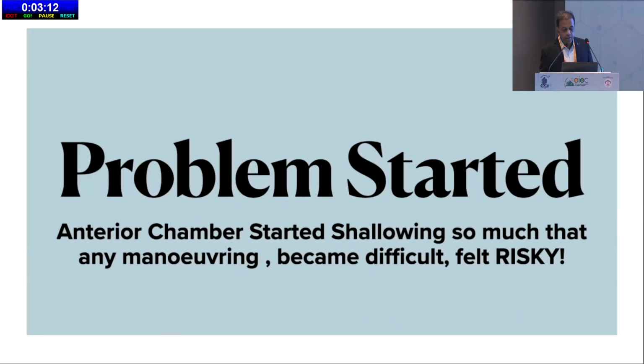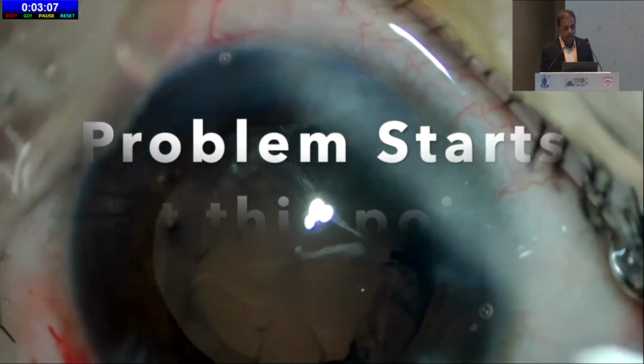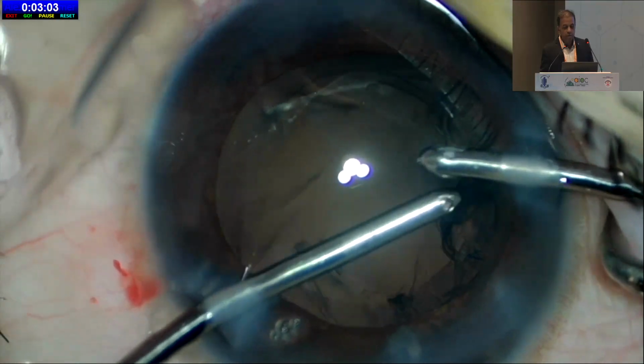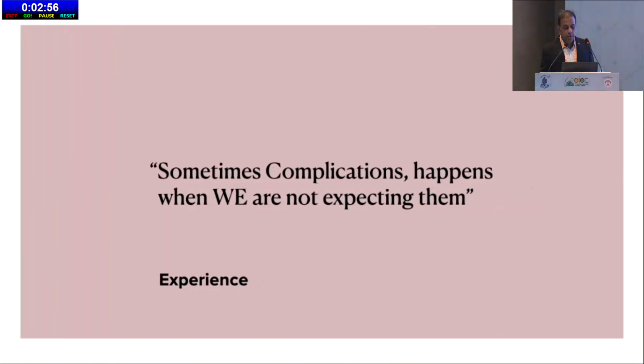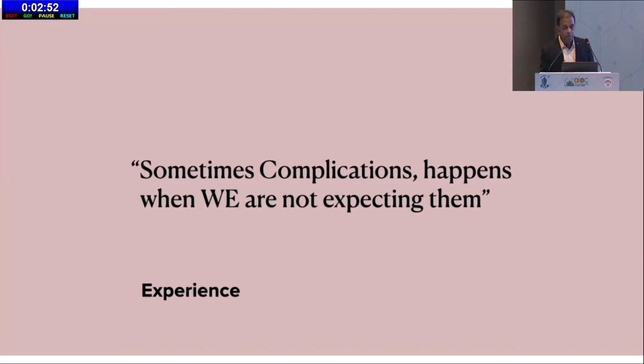The anterior chamber started shallowing so much so that any maneuvering felt risky. The PC started bulging upward, and introduction of any instrument would most probably touch the posterior capsule. Sometimes complications happen when we least expect them, and this was the same case.